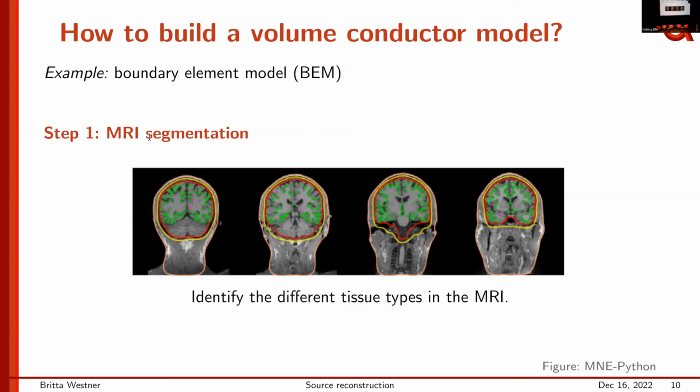And if you now build a 3D model out of this with the boundaries, it will kind of loop. And that creates problems in the solving. It's not possible to solve a boundary element model for that. Of course, this can be fixed, but the problem is really this first stage. I think by now we have better algorithms to fix such things.